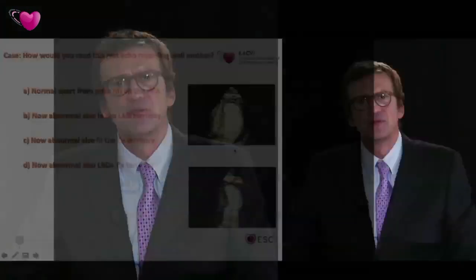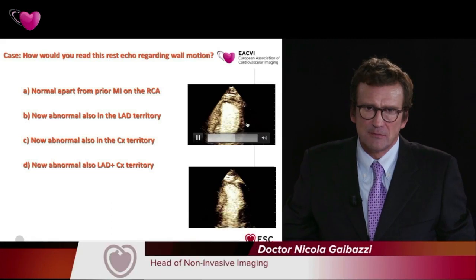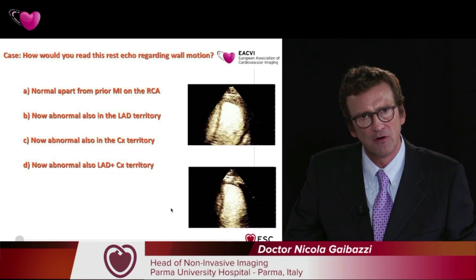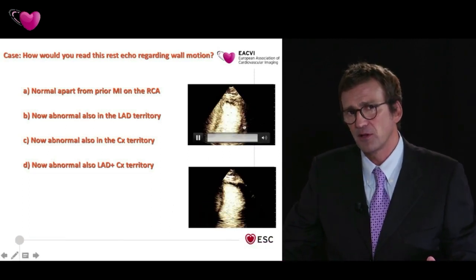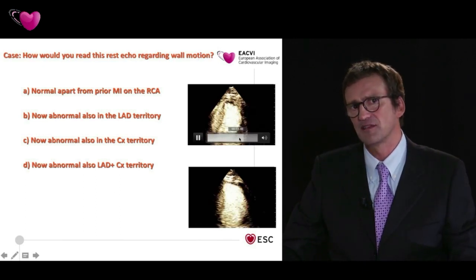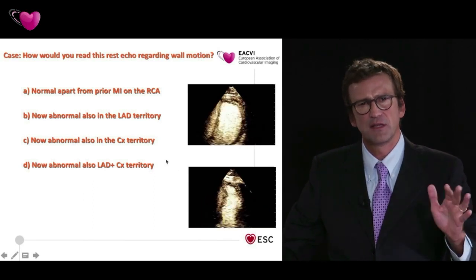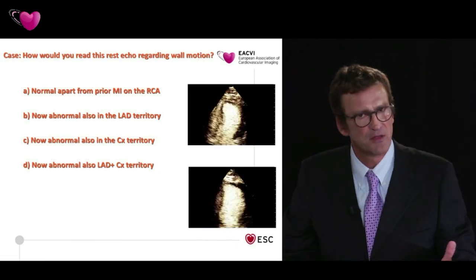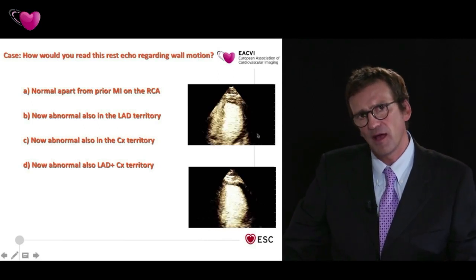of contrast. We should say that contrast is not perfect, and you need a lot of experience for perfusion in particular. Probably they interpreted the typical artifact in the circumflex territory as something positive at some point here, but this needs caution. You can see when it passes through that there are frames where you can see perfect perfusion there. It's just when the people breathe that you can have those types of artifacts.